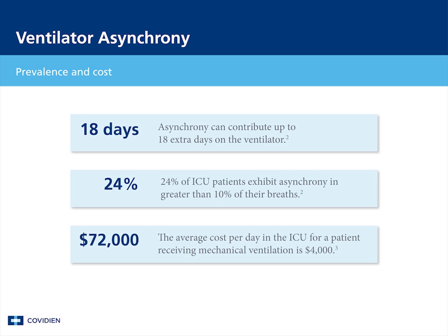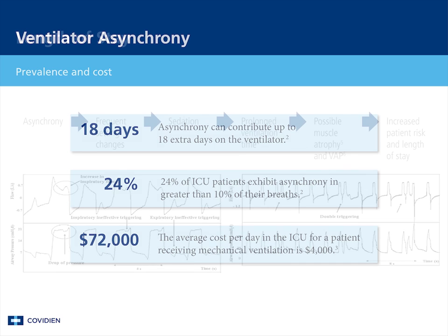In another large study, involving historical review of more than 51,000 patients, researchers calculated that the average cost per day in the intensive care unit is almost $4,000. With these studies, an estimated cost of up to $72,000 per patient can be attributed to ventilator asynchrony.